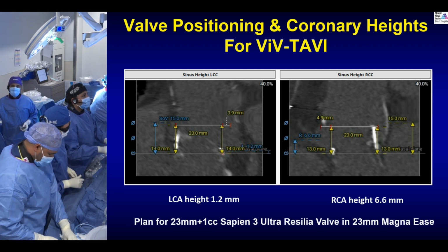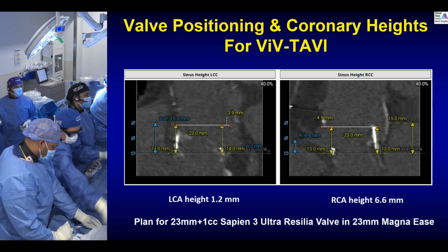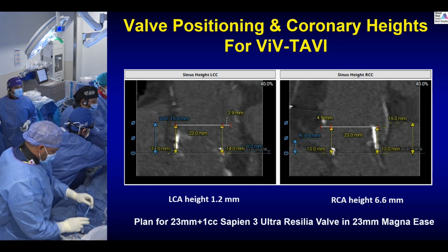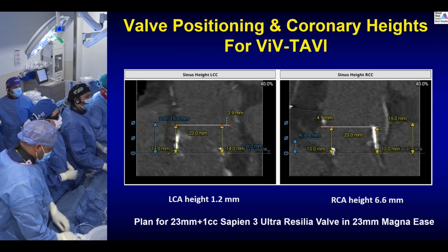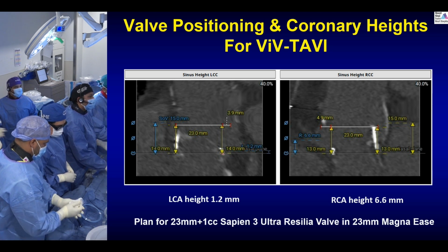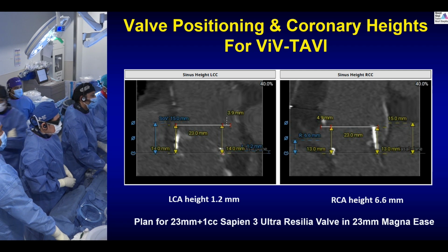He has a lifetime management of Hodgkin's lymphoma with chemotherapy, and he may not outlast this valve. Samir and Gilbert, fantastic case. It's written all over the case. It's written complexity, right, starting from the aortic level, as Gilbert has already alluded. It's a replaced ascending aorta, so that junction is notorious for giving way.